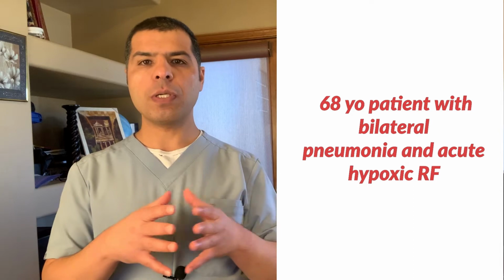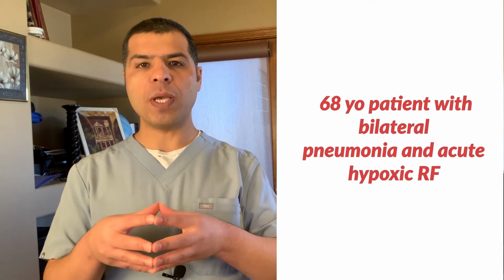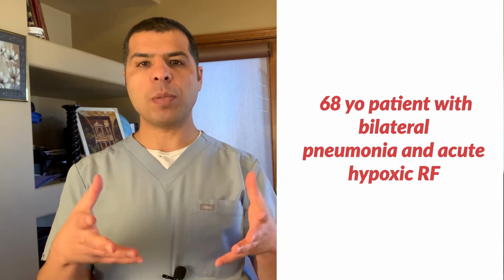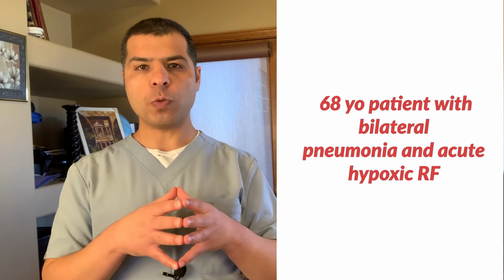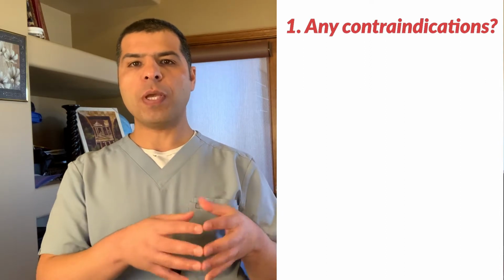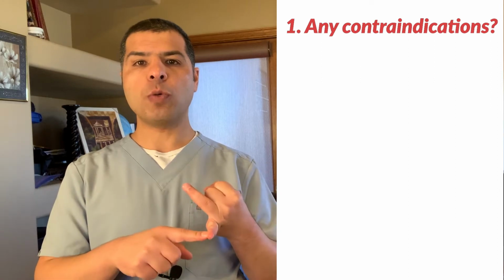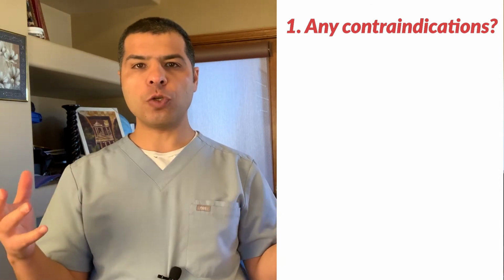But later during his hospitalization, he changed his mind and agreed to be intubated as he was getting very hypoxic despite the maximum amount of oxygen provided through CPAP. So we decided to proceed with intubation. So the first step: is there any contraindication to intubate this gentleman? The patient is okay to be intubated. He himself said he wants to be intubated. There is no clear contraindication to proceed with intubation to me.